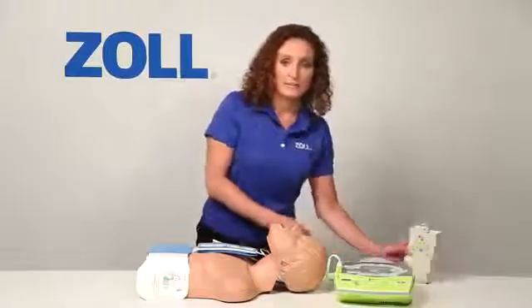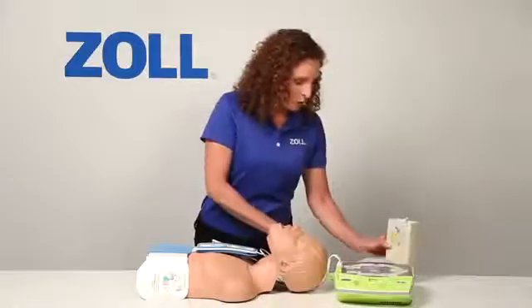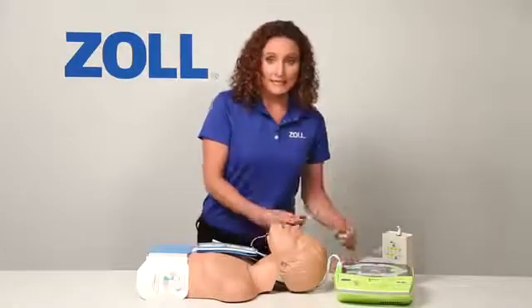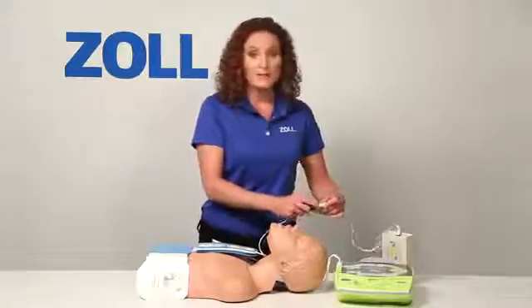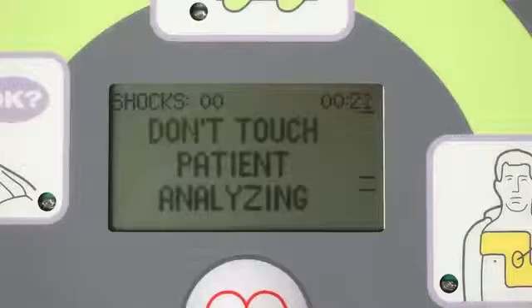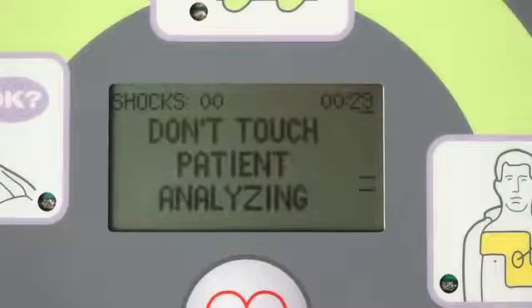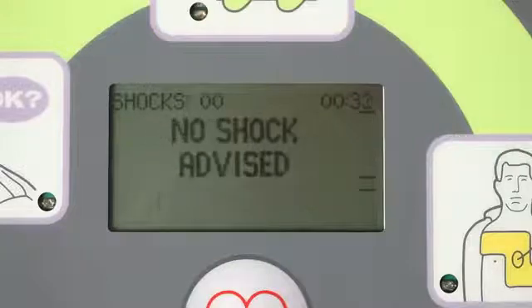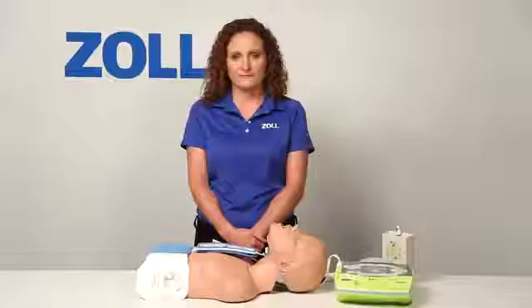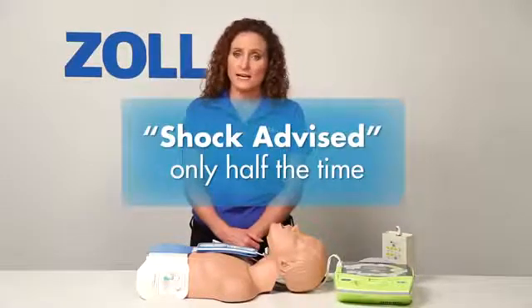I will set the simulator to present asystole, an unshockable rhythm. When I plug it in, the AED Plus recognizes the presence of a heart rhythm and begins analyzing it. Don't touch patient. Analyzing. Don't touch patient. Analyzing. No shock advised. Start CPR.